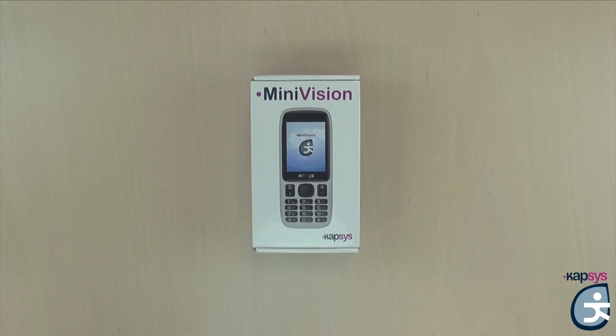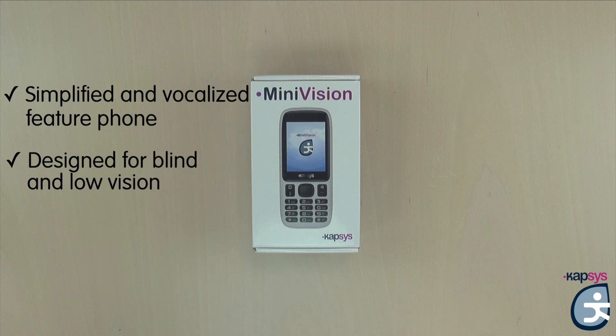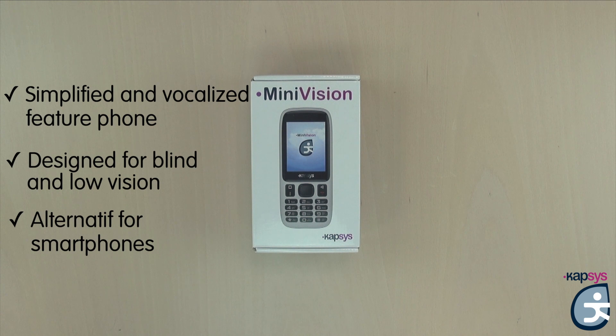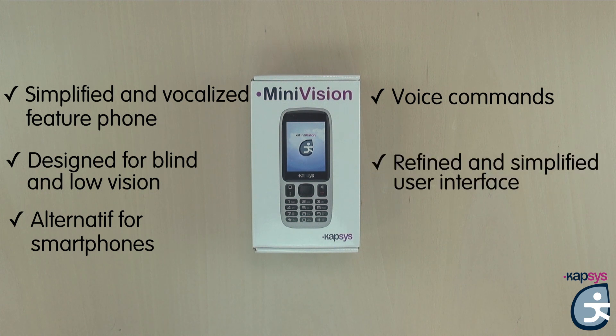Hello everyone and welcome to Capsys channel for a new tutorial to present the Minivision, the new simplified and vocalized phone from Capsys. This phone is for the blind and visually impaired people who do not want smartphones, simply because they do not need one or because they find it too complicated. Minivision is a really simple phone, fully vocalized with voice commands to do certain actions vocally, such as call contacts or send a text message. Its streamlined and simplified interface will allow you to use the phone intuitively and easily.